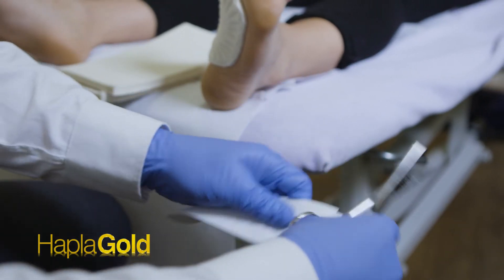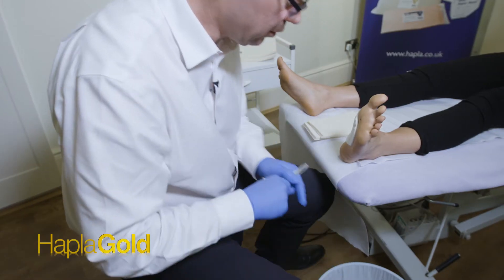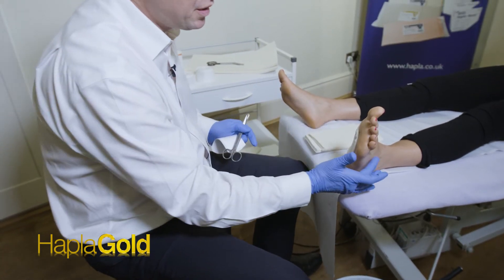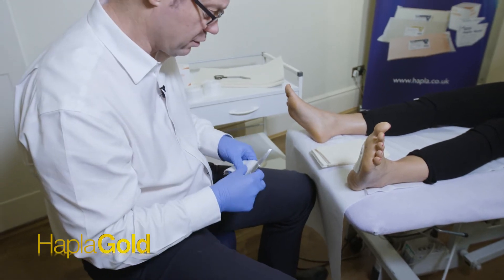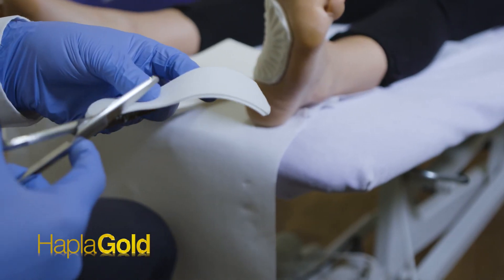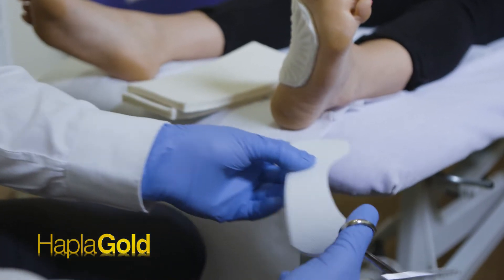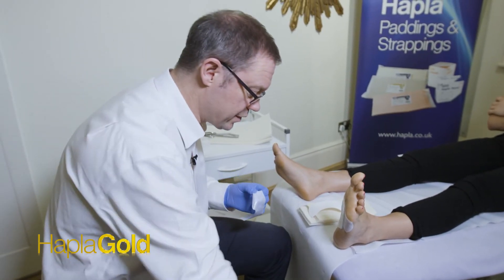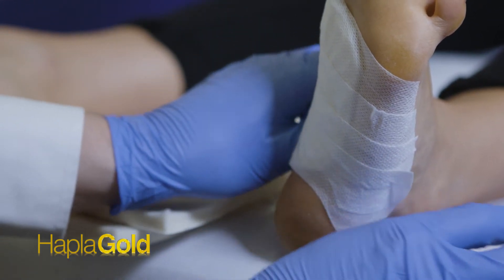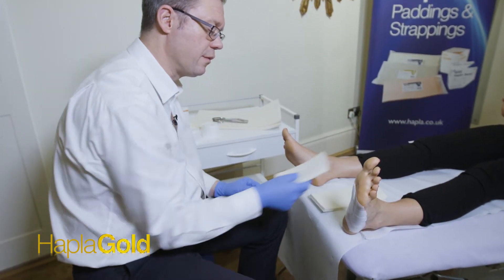We round off the edges of the retentive strapping so it doesn't catch on hosiery. The strapping will go over the pad and slightly up the lateral side and slightly up the medial side, but not encroach too far onto the dorsum of the foot. Into this tape we also cut a slight curve which helps it round the corners of the pad. By adding the valgus filler you're also increasing the weight bearing surface of the foot in the arch area, and this further offloads the forefoot too. That's the valgus filler portion of the 3D system.